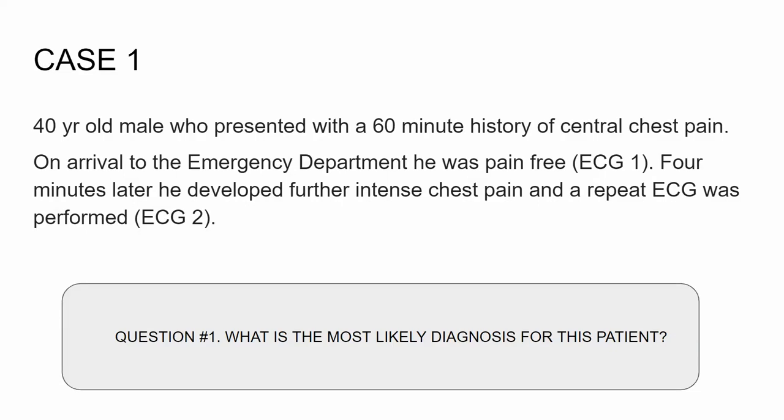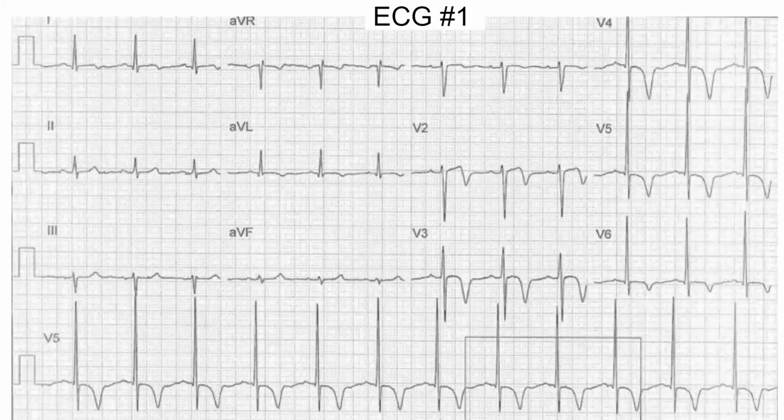Case number one: a 40-year-old male comes in with a history of chest pain, comes into the emergency department. He was pain-free. Then four minutes later, he had more chest pain and he got a repeat EKG. So the first EKG: we see a lot of T-wave inversion down there in the lead five rhythm strip. We wonder about ischemia because V4, V5, and V6 all have what looks to be some T-wave inversion, even around V3.